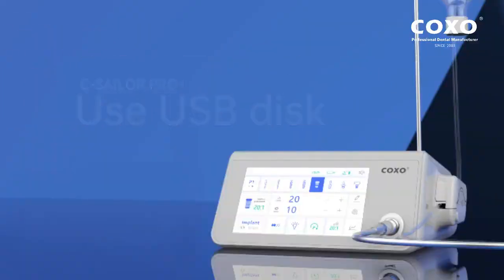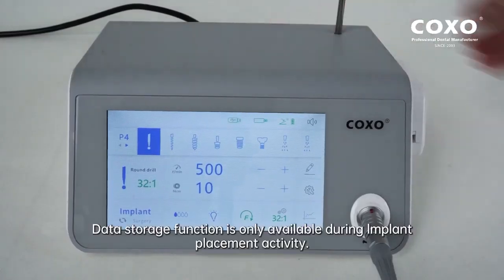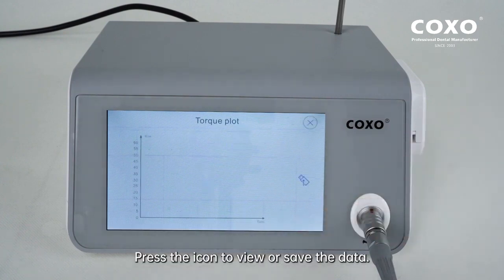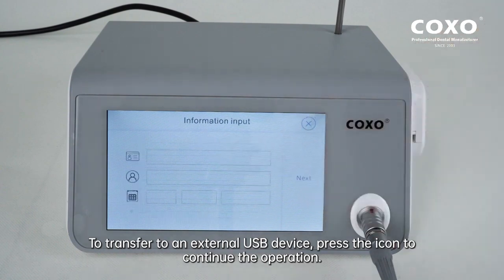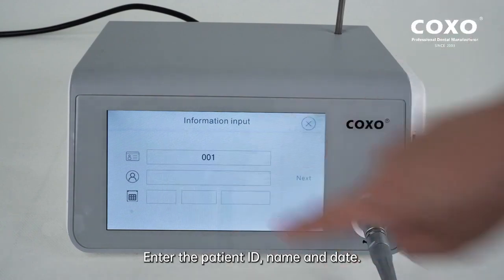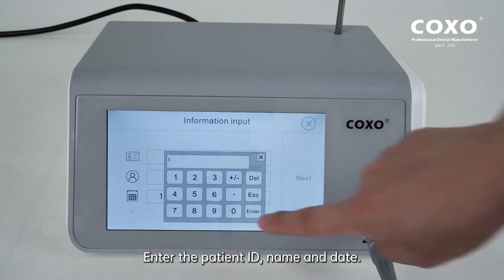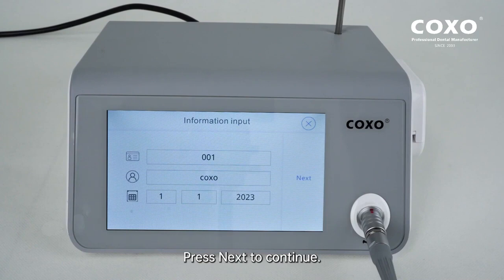Use USB disk. Insert the data USB drive. Data storage function is only available during implant placement activity. Press the icon to view or save the data. To transfer to an external USB device, press the icon to continue the operation. Enter the patient ID, name, and date.